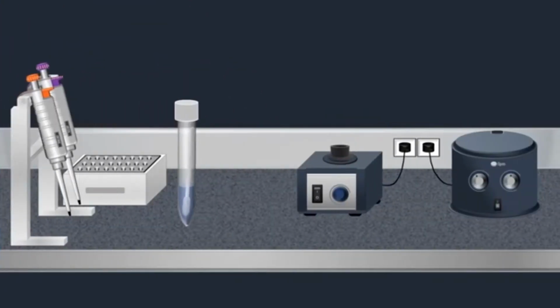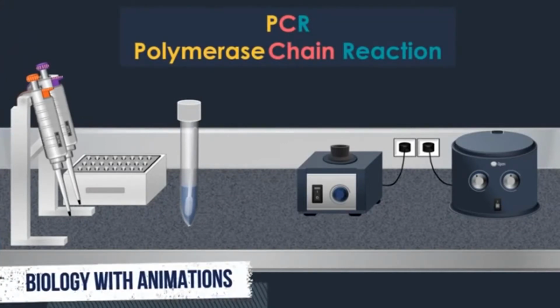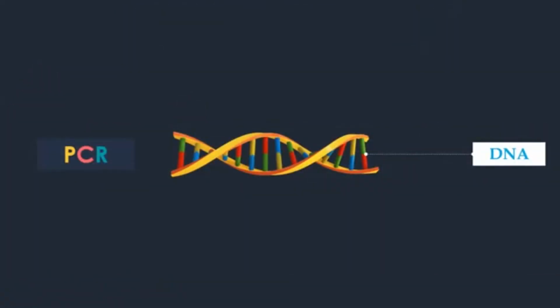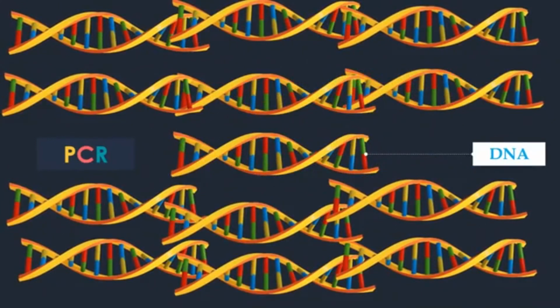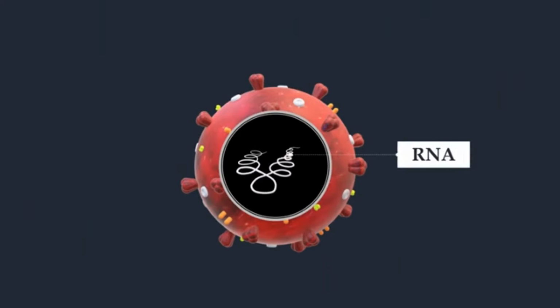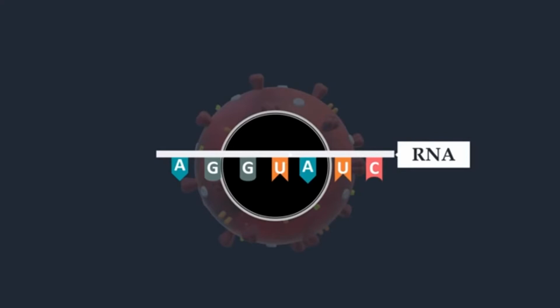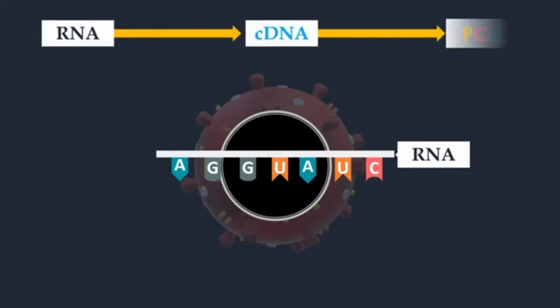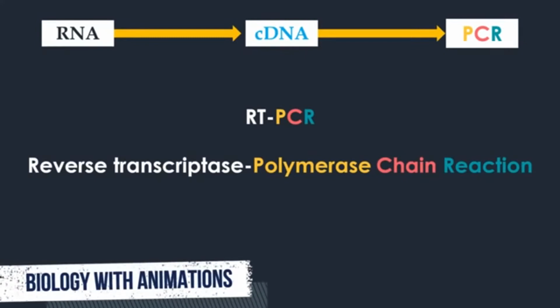The standard method of coronavirus testing is polymerase chain reaction (PCR), which is a method widely used in molecular biology to make millions to billions of copies of a specific DNA fragment rapidly. Coronaviruses contain an extraordinarily long single-stranded RNA genome. To detect these viruses with PCR, RNA molecules must be converted into their complementary DNA sequences by reverse transcriptase. Then the newly synthesized DNA can be amplified by standard PCR procedures. This approach is universally known as RT PCR.